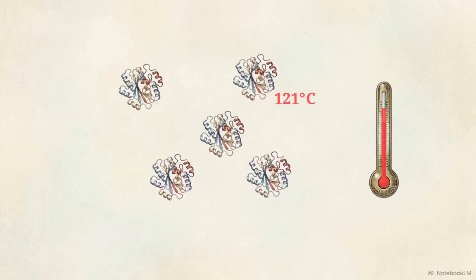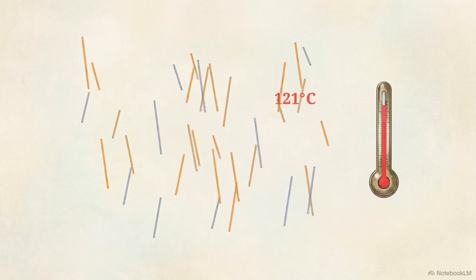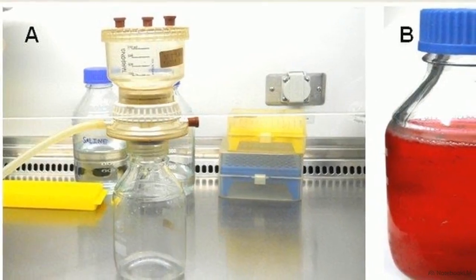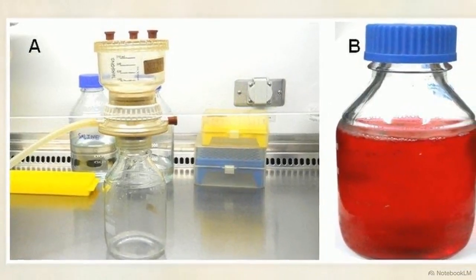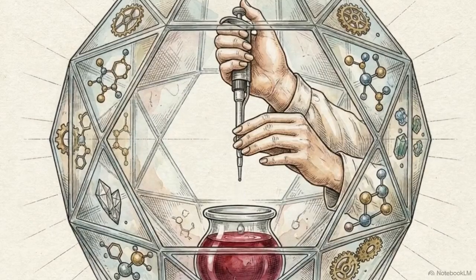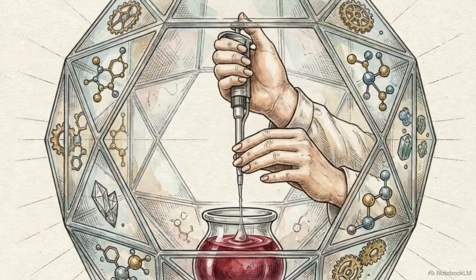The complex proteins and vitamins in animal serum are heat labile and would be destroyed by the heat of an autoclave. Consequently, mammalian media requires cold, mechanical sterilization. The liquid medium is forced through a sterilized membrane filter with a microscopic pore size of exactly 0.22 microns, physically removing potential contaminants. Once filtered, adding any remaining supplements requires absolutely flawless aseptic technique, as any oversight leads to immediate contamination.